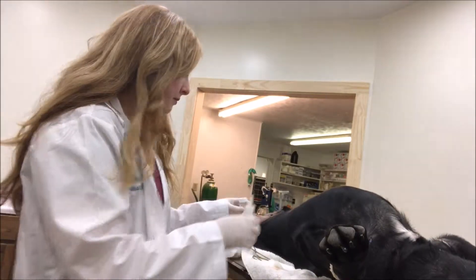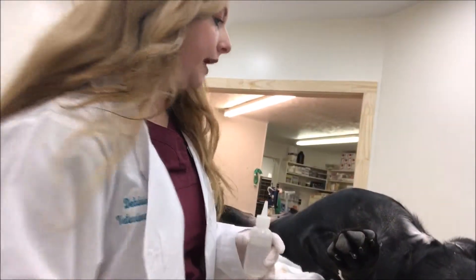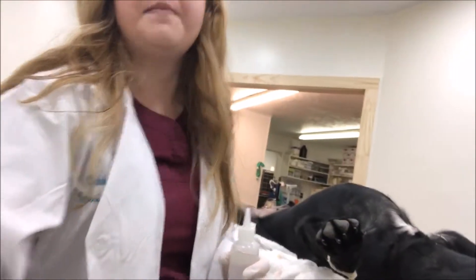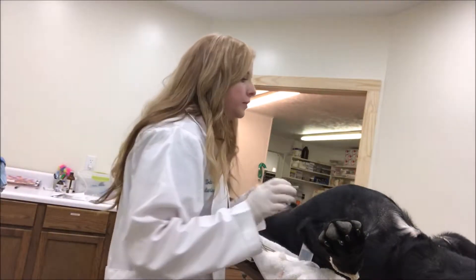Hi, this is Debbie Gray. We're going to do our culture for dermatophytes, which is ringworm. We've got a big boy here, our good friend Kobe, and he's got some really nasty skin. We're going to do a few different tests on him: a dermatophyte culture, a skin scrape, and a bacterial culture. We have to pick a lesion.